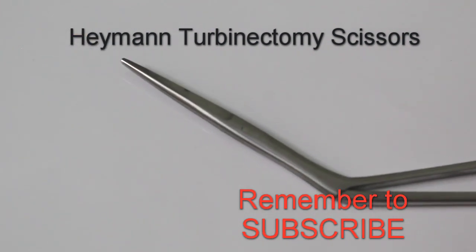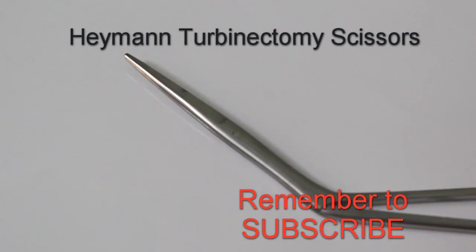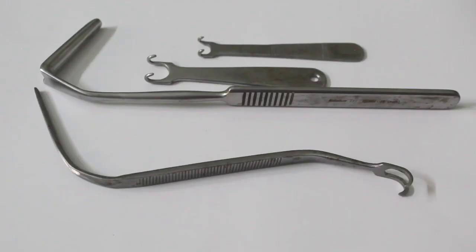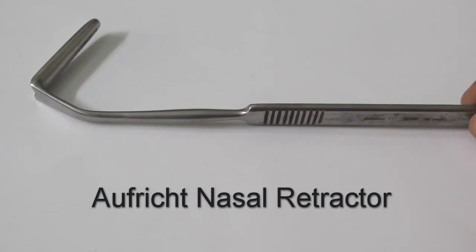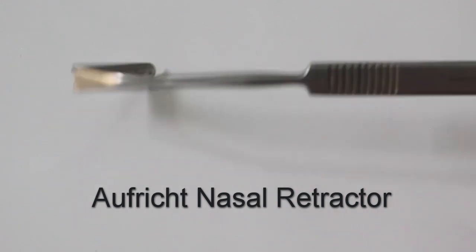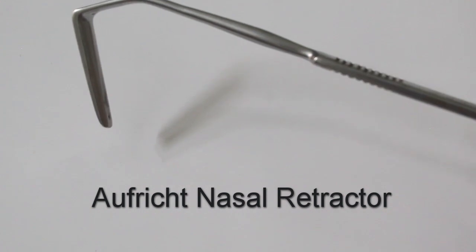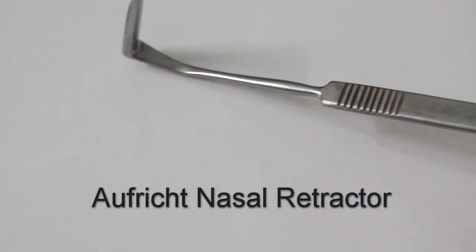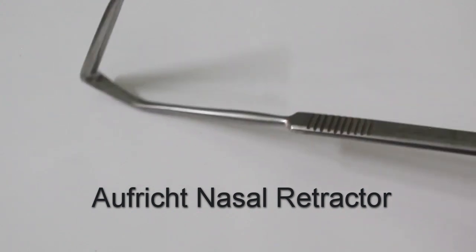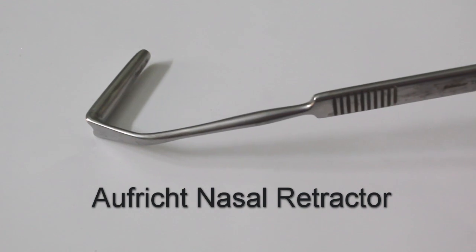You can see the tip — it is angled, designed for turbinatectomy. The most needed instruments for rhinoplasty are different types of retractors. This retractor is highly protective; the long lateral blades retract the soft tissue and improve visibility. It will especially retract the flap after elevating it.